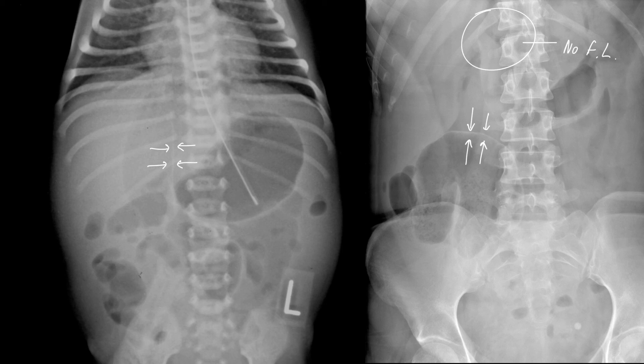So in children, this is more likely to be seen, whereas in adults, because the liver is relatively small compared to the rest of the abdomen, the falciform ligament tends to be oblique to the beam, and then you won't see it.